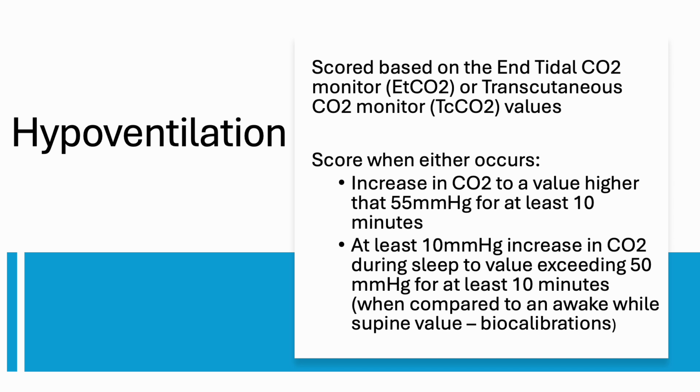CO2 is the primary respiratory driver. Too much CO2 means you have to breathe off more of it. It's the CO2 that builds up and makes your brain wake up. Hypoventilation is scored on the values collected with a CO2 monitor, which we call a capnograph.